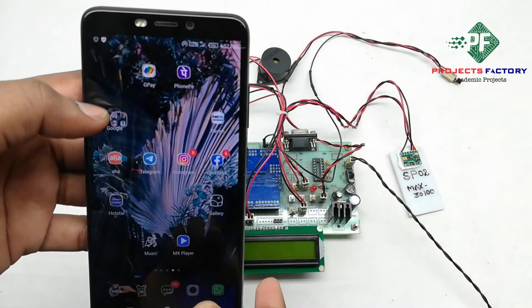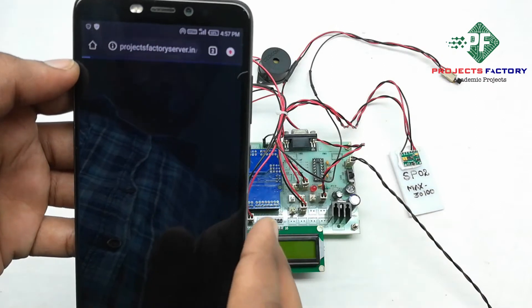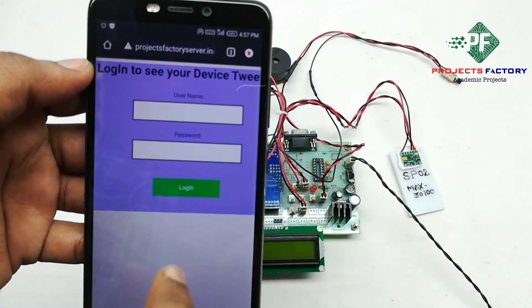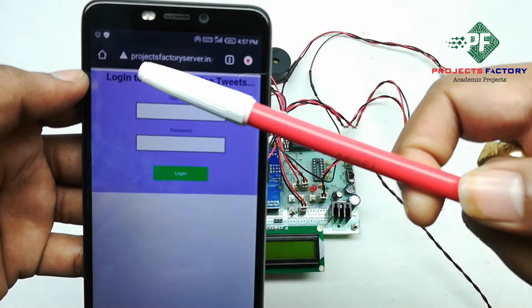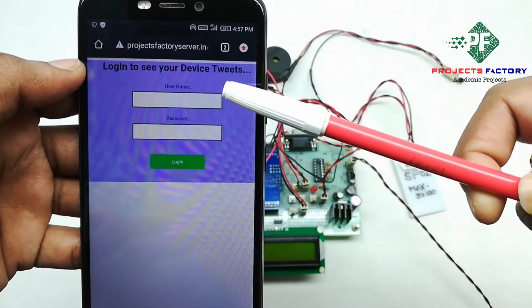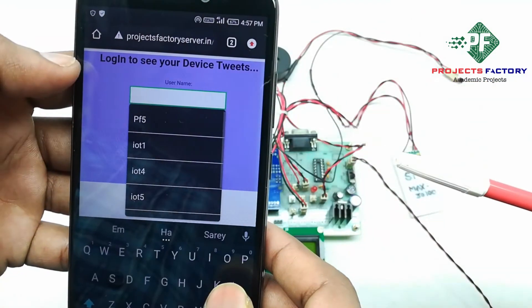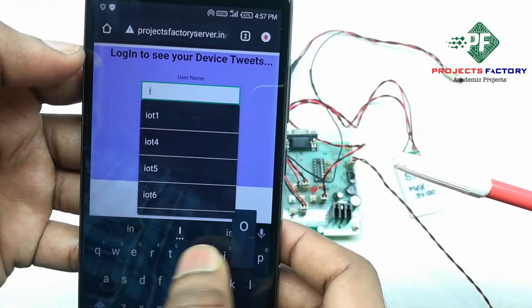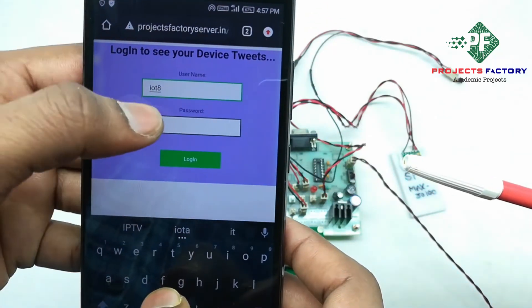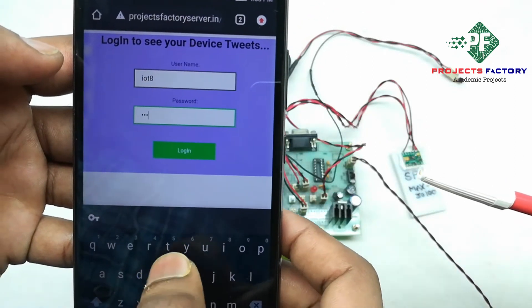This URL can be opened on our mobile or laptop. We can see that the URL is projectfactoryserver.in and it is asking for a username and password. The username is IOT8.